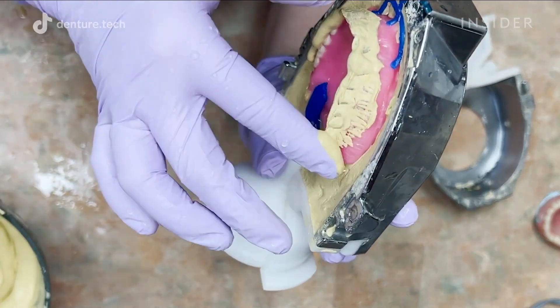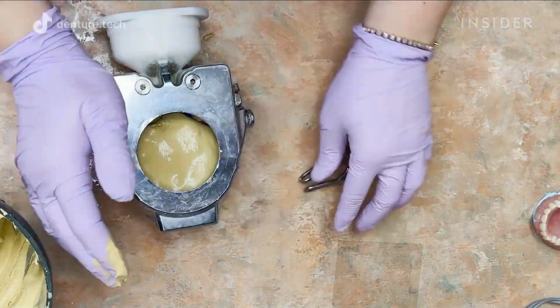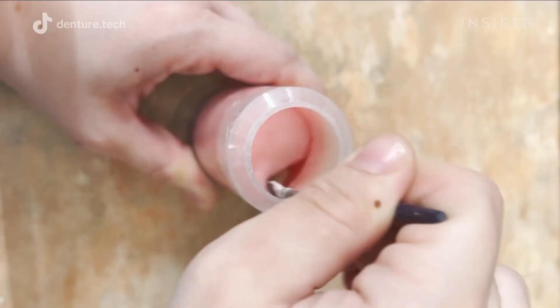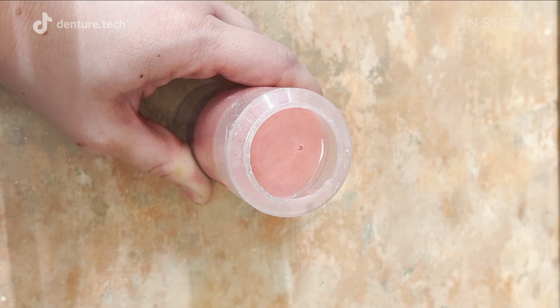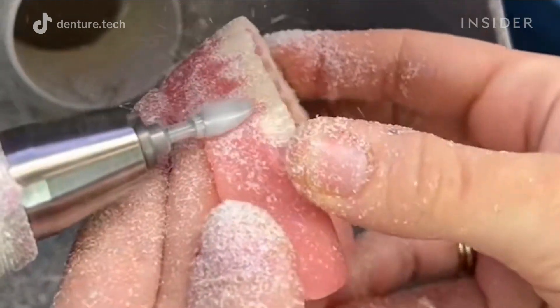Next, the dentures are placed in a flask, where plaster is poured on top. This process is called flasking and it helps maintain the shape of the teeth. Hot water is then poured onto them to melt off the wax base. Once all the wax is melted off, acrylic can be injected to replace the wax base and complete the dentures. Acrylic is one of the easiest denture materials to adjust and is typically more comfortable for the patient.